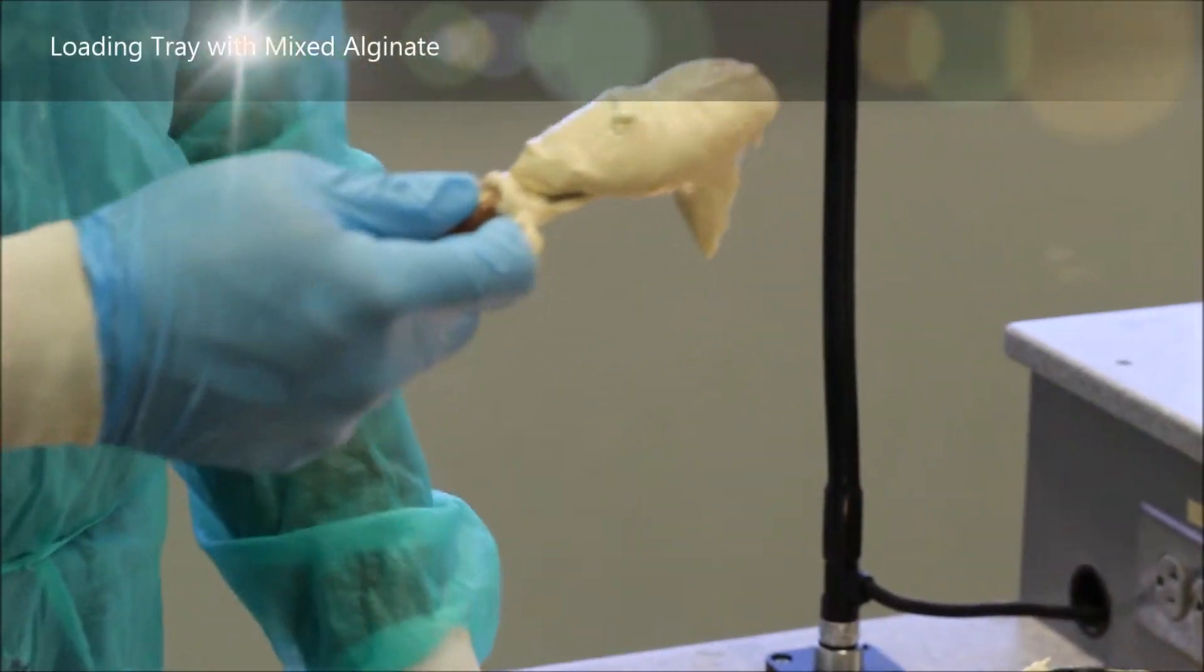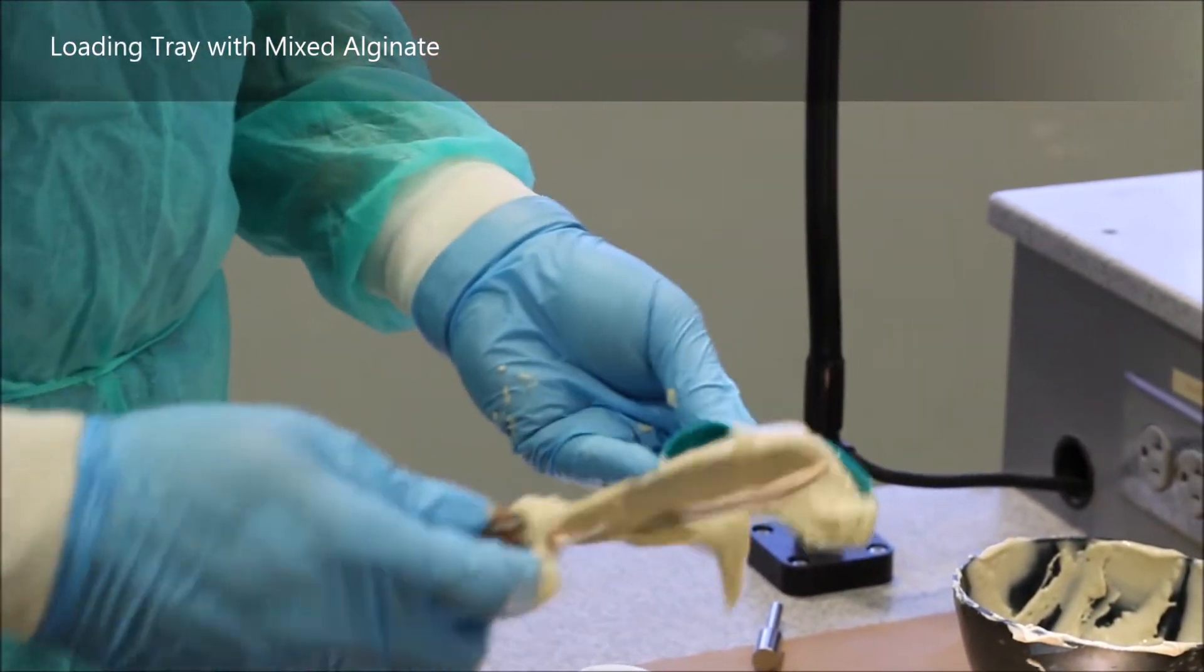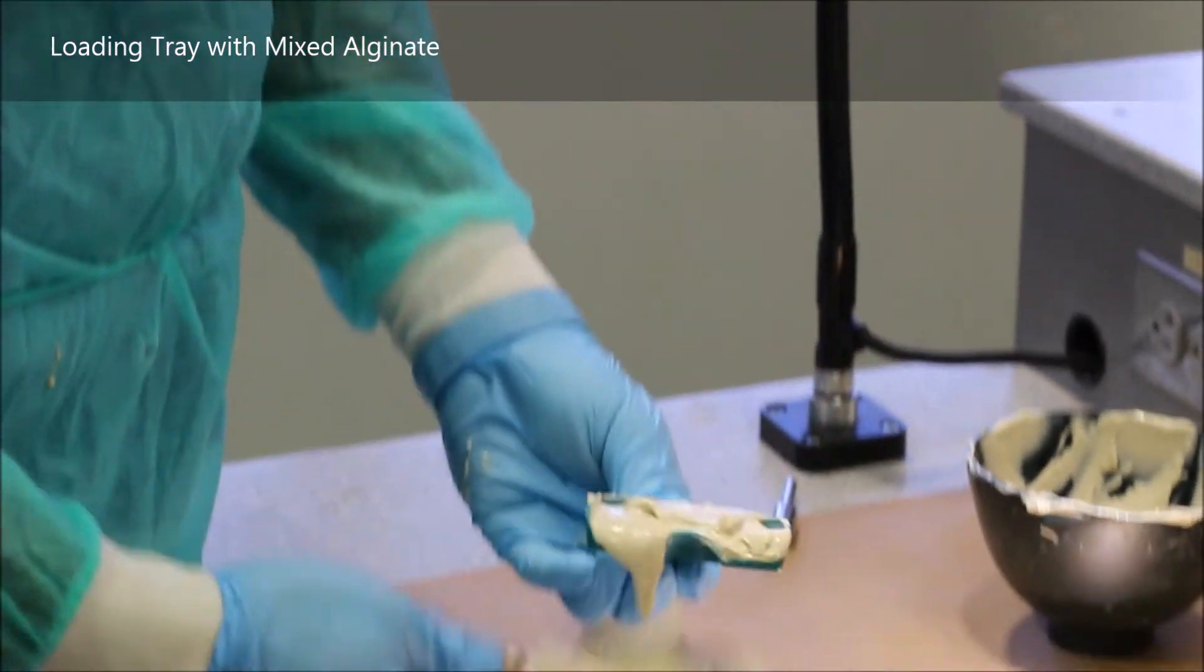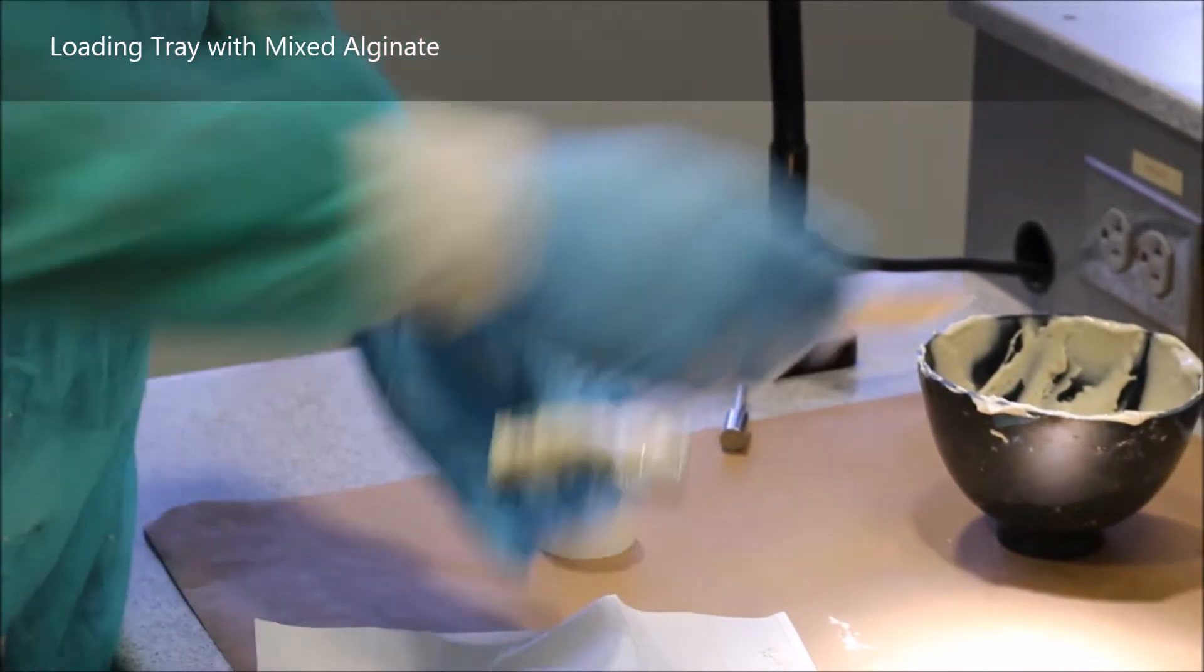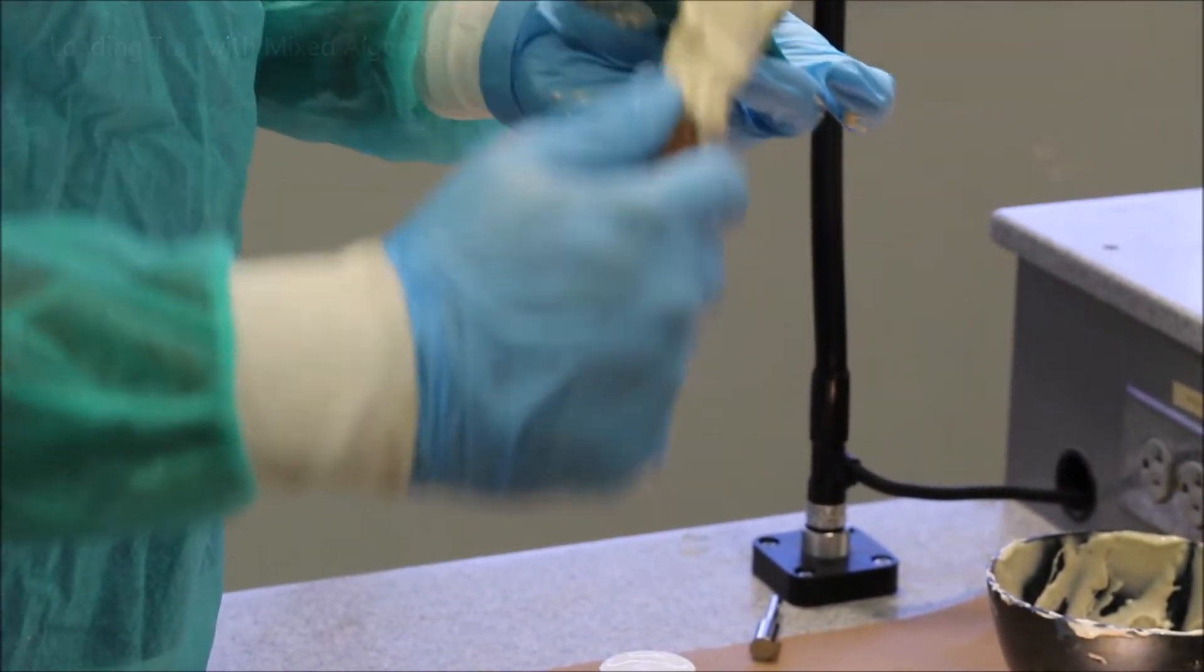Having done this sufficiently, I will now take a good amount of my impression material and load it onto the maxillary tray. You load it from the posterior and flatten it towards the anterior. I didn't get as much as I wanted, so I'm going for a second swipe.